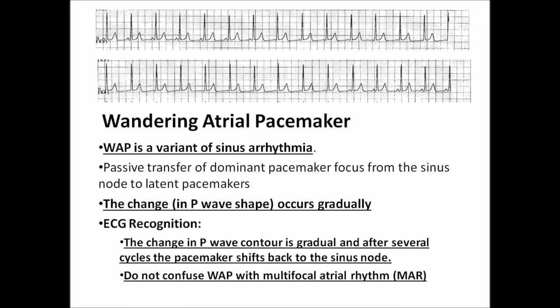Wandering atrial pacemaker, or WAP, is a variant of sinus arrhythmia. There is a passive transfer of the dominant pacemaker focus from the sinus node to latent pacemakers. The change in P wave shape occurs gradually, so there is only one pacemaker in control at a time. It is recognized on the surface EKG with a gradual change in P wave contour over several cycles, after which the pacemaker shifts back to the sinus node. Do not confuse WAP with multifocal atrial rhythm. These 10-second lead 2 strips were intentionally printed to illustrate the gradual change of P wave contour and morphology.